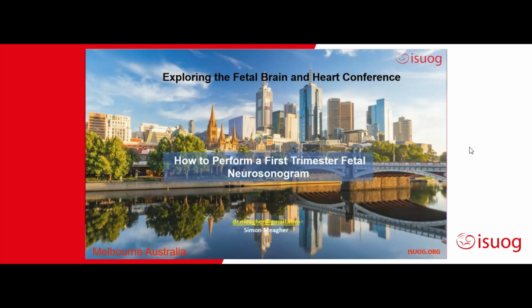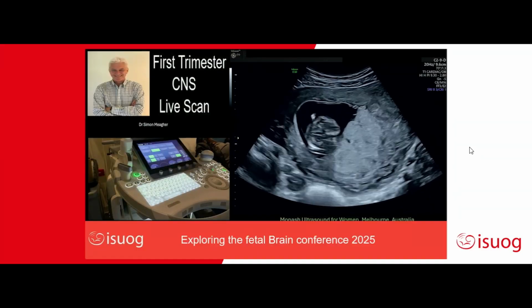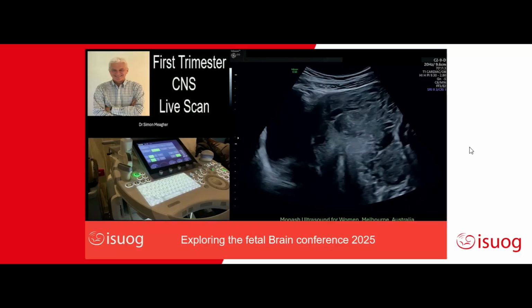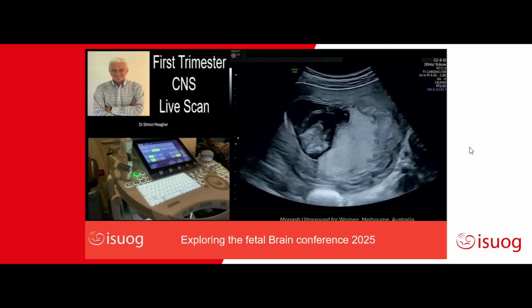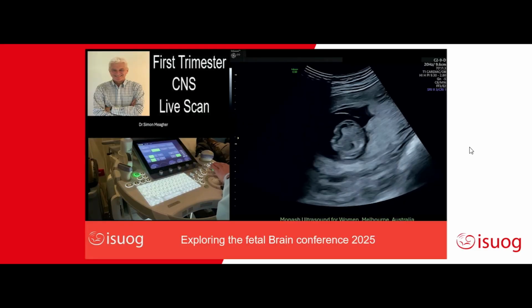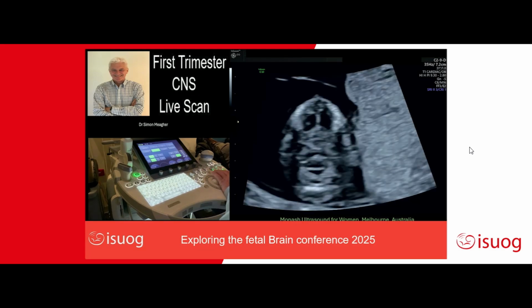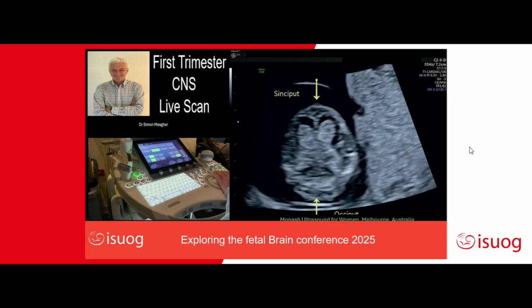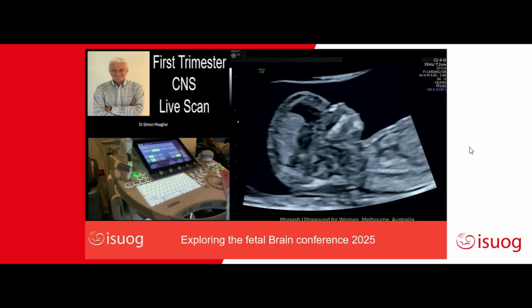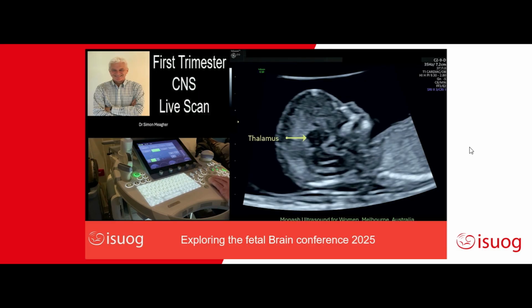Next I just want to do is the intracranial translucency measurement. So I just do a sweep of the baby's head from top to bottom on the fetus. And then when getting the intracranial anatomy, I like to get the head so I've got the occiput up at 12 o'clock, the symmetry of the brain, and then I sweep 90 degrees to that, and that will bring me my landmarks in very predictably. That's my preferred way of getting intracranial translucency, rather than just randomly taking a sagittal image.